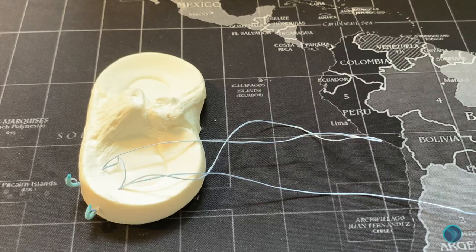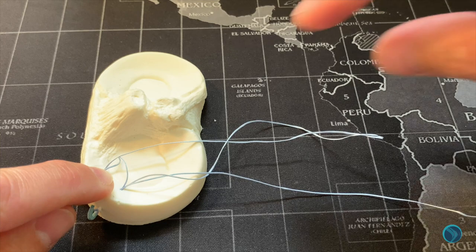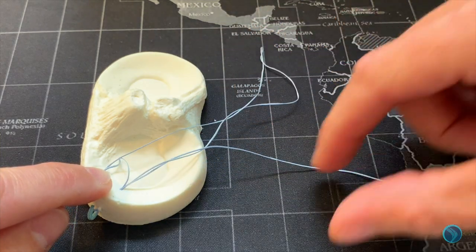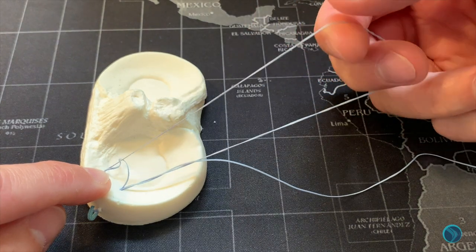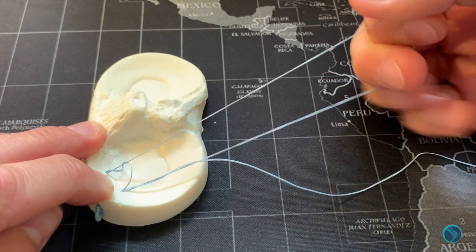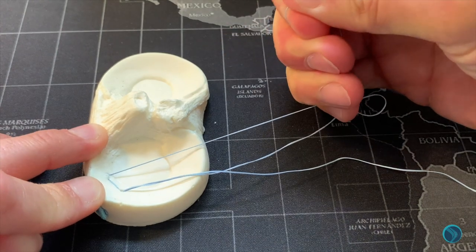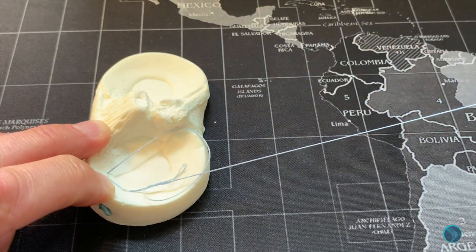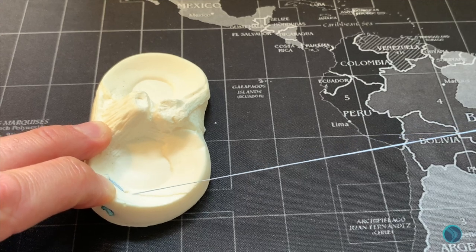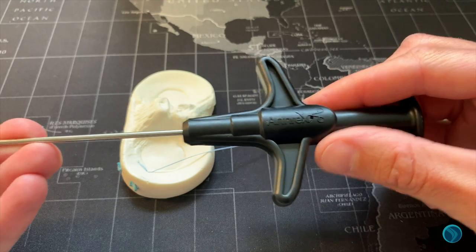Once the device and needle have been removed from the portal, you're left with your mattress suture that's going to close down the meniscal pathology initially, a second loop, and a single suture. Using an arthroscopic hook or your fingers if it's exited the portal, pull on this initial loop to tighten the first mattress suture down. Once that's tight, secondarily pull on the single end to gather the remaining second mattress suture and tension the fixation using either the disposable or the cutter.